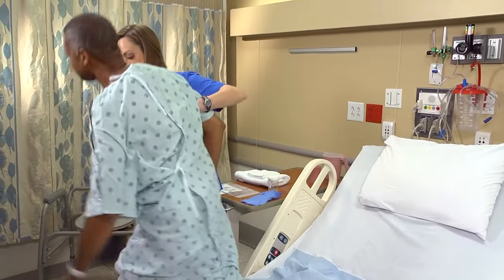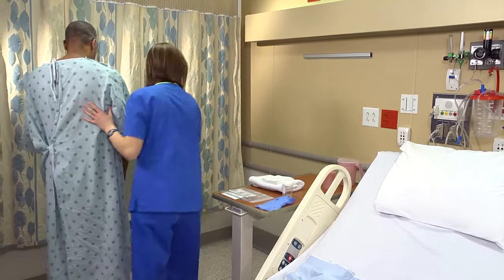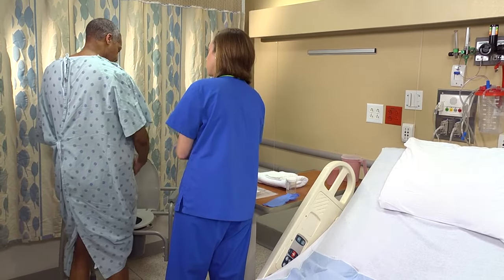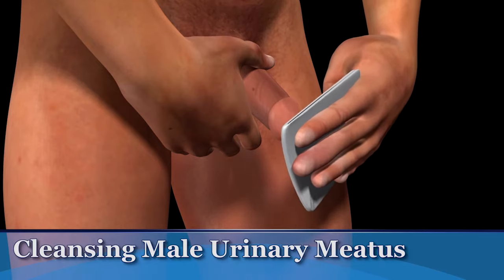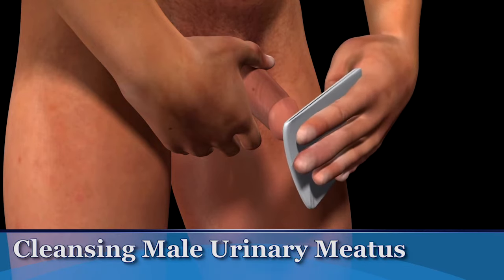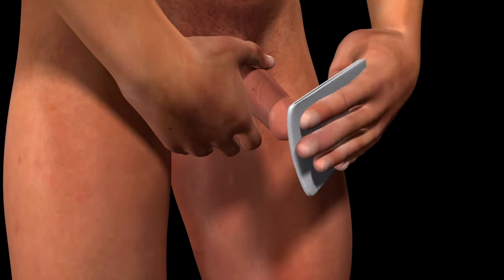Allow the patient to cleanse his perineum and collect the specimen if he's able to do so on his own. If he needs your help, hold the penis in one hand and use a circular motion to cleanse the meatus with an antiseptic towelette, moving from the center to the outside. Cleanse the area three times using three different towelettes.